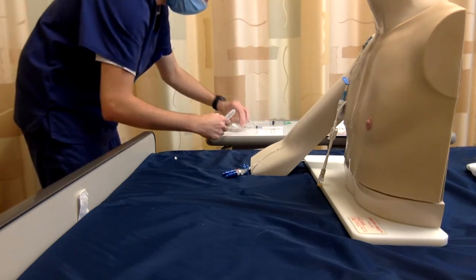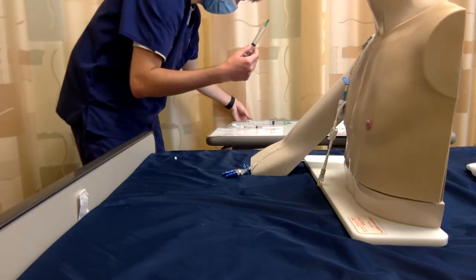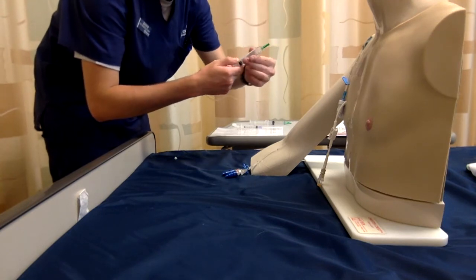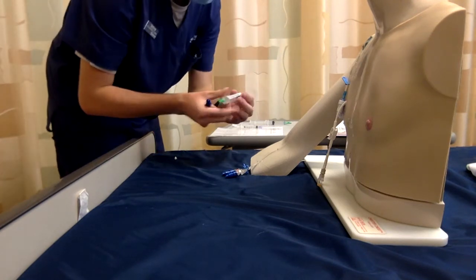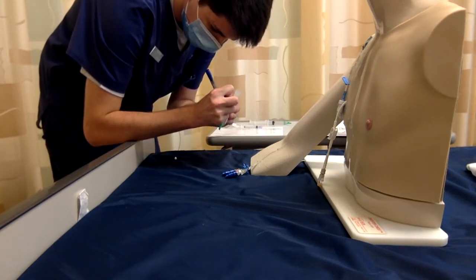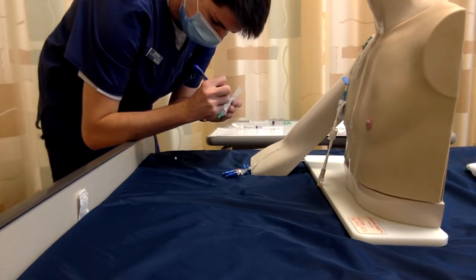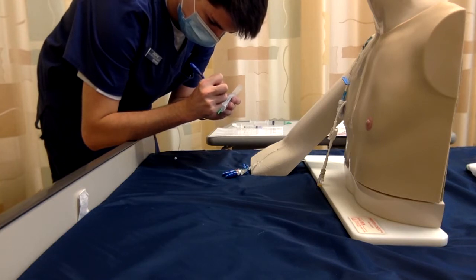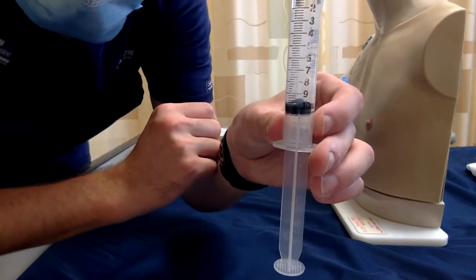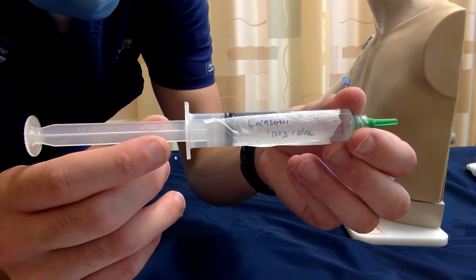And get rid of all the air bubbles. So now I'm going to label my medication with my tape here. So I have my 10 mils of Lorazepam, 1 milligram in 10 mils.